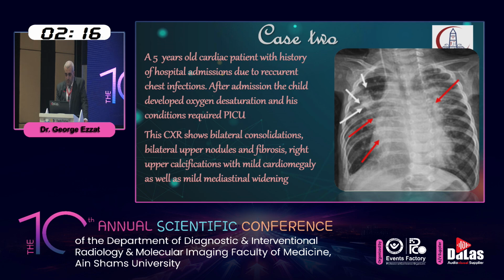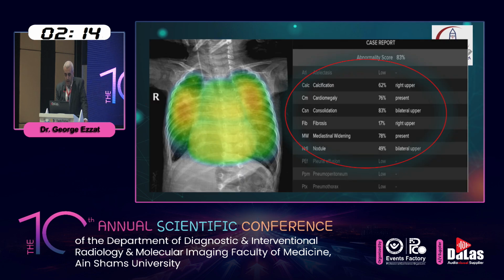This was a case with multiple findings, and actually the AI did well and picked up most of the findings. It showed the bilateral consolidations, the cardiomegaly, and the reticulonodular densities, as well as the right upper zonal calcification.